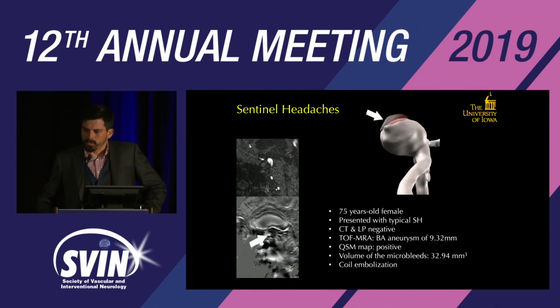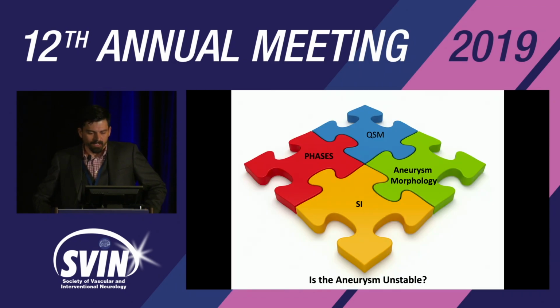And we published a couple of series. Oh, I still have 40 seconds. We were able to identify microhemorrhages within the aneurysm and sentinel hemorrhages.